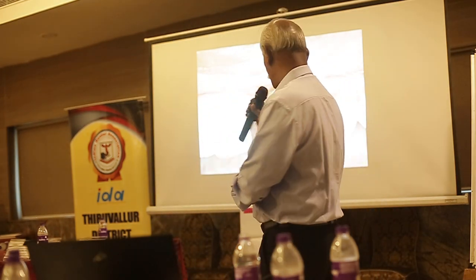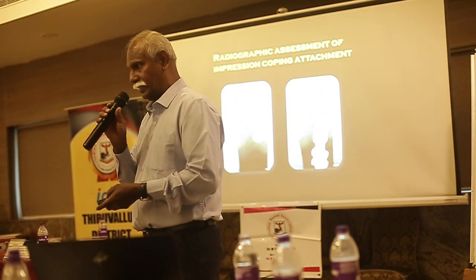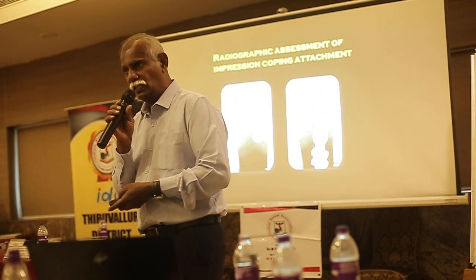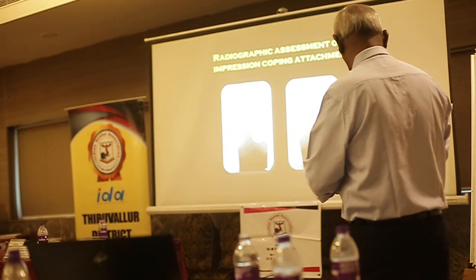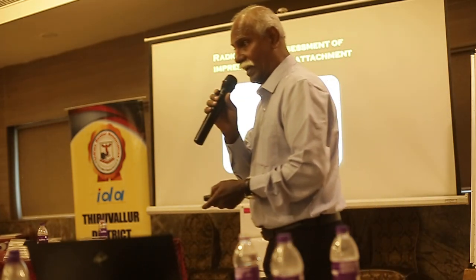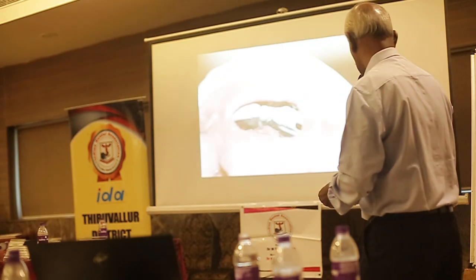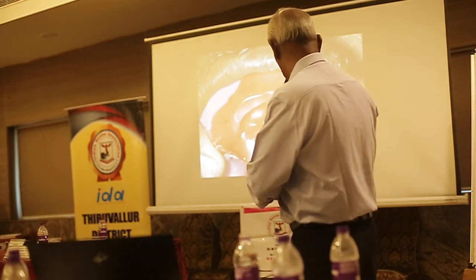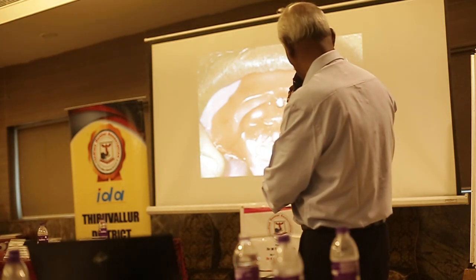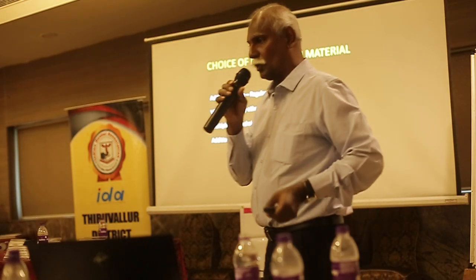So, transfer coping. Attach the transfer coping, check the radiograph for the close adaptation of the transfer coping to the underlying implants. Make sure you don't see a gap between the transfer coping and the implants. Open tray technique. Try the tray in the patient's mouth. See that the pin comes through the access hole.